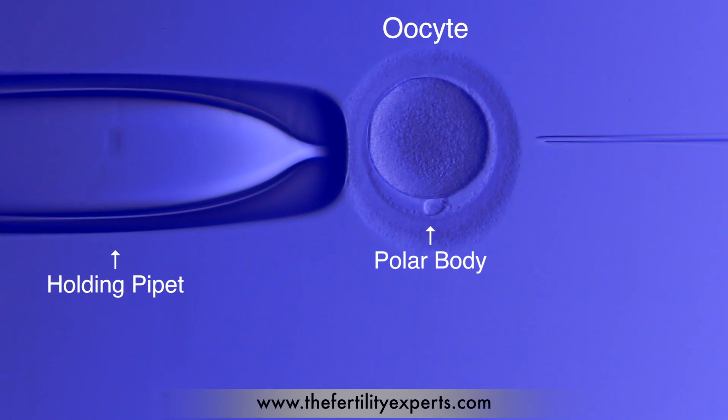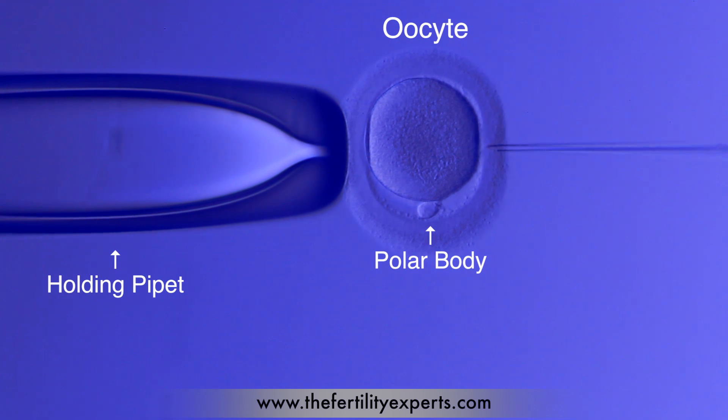A mature oocyte is held in place and manipulated so that the sperm can be injected at a 90-degree angle to the polar body.